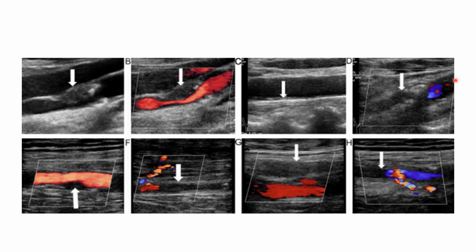Now here you see something where this is probably the external carotid. And so at the bulb here, we're seeing some flow. The lack of flow here could either be a scale problem, so we'd want to decrease our scale, making it more and more sensitive. We'd want to increase our color gain. And if we still couldn't get any flow here, that would indicate that there is possible occlusion. But you want to pull out all the stops with your scale, your gain, all of that to make sure that there truly isn't any flow there, because that difference between a minimal amount of flow and no flow at all means that patient's a surgical candidate versus is not.